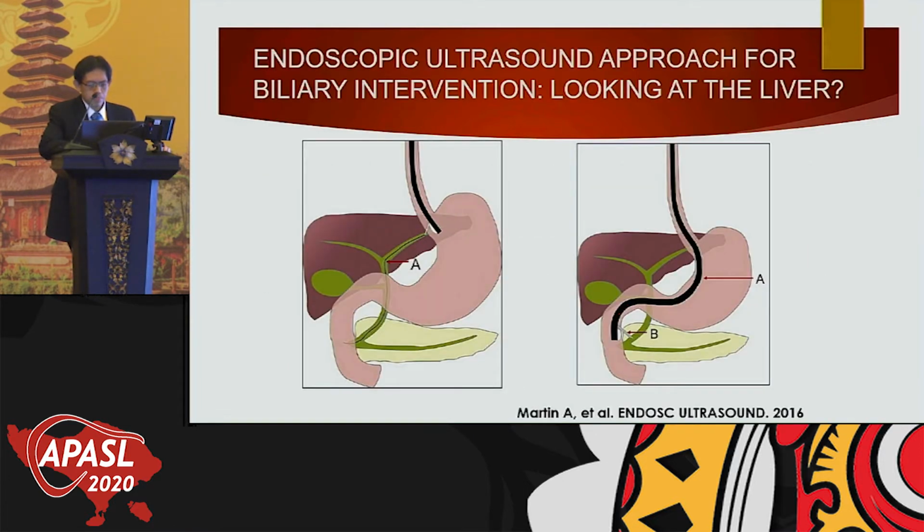Many endoscopists in your centers perform EUS. When they do many EUS procedures for biliary intervention, in fact, they are also looking at the liver, because they always pass the liver when they perform the biliary intervention.